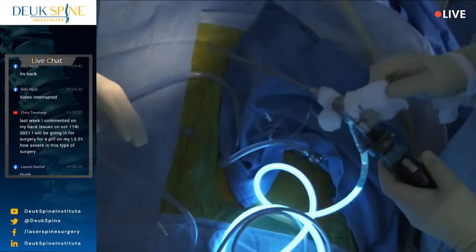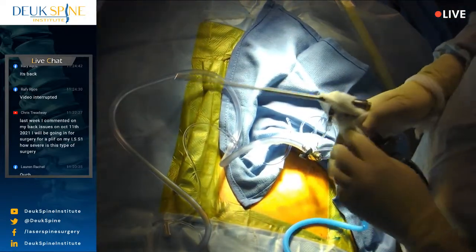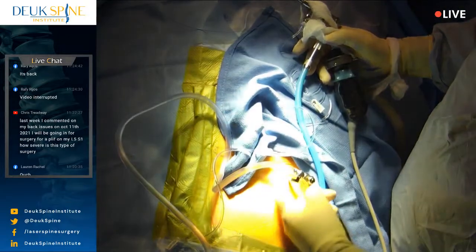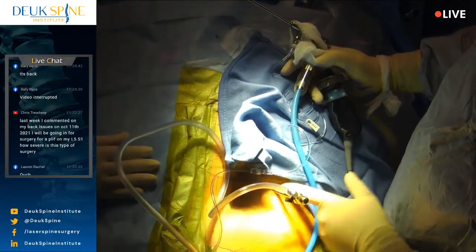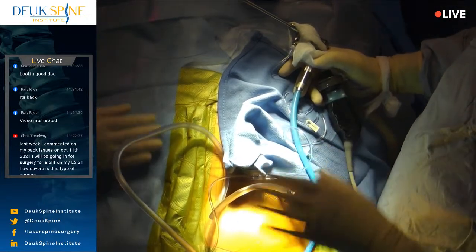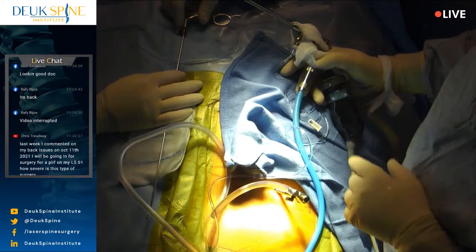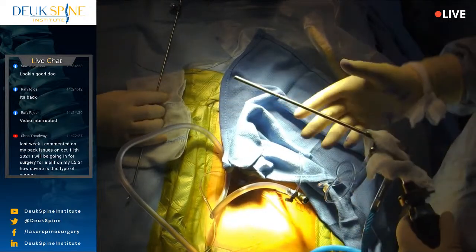Let's show them the scope. Zach, can you show them the endoscope? They can see it. All right, so take a look at this thing. It's pretty cool. So we've got this tube going in right through the tear. So there's no damage to our patient's body except for the incision in the skin, which is like nothing. Okay? So 7 mm incision, and then what we've done is we've spread the muscles and tissues under the skin without damaging them. There's no damage. And then we get to the herniation and we touched it and shoved it back in through the tear. And now I'm going to take the pieces out from inside the disc, and at the tear I'm going to do a debridement. And all that's done endoscopically using this beautiful endoscope.